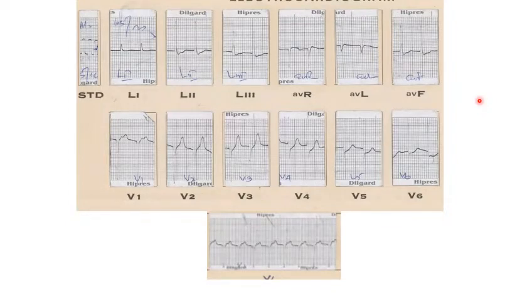There is evidence, sir, of old anterior wall MI as evidenced by Q in lead 1, AVL, and also Q in V1 to V2. Lead 1, yes, AVL. Do you give so much importance to the Q wave? Well, I agree with you, there is a QS pattern in V1 as well as in V2. There is, yes, a rudimentary R in V3.